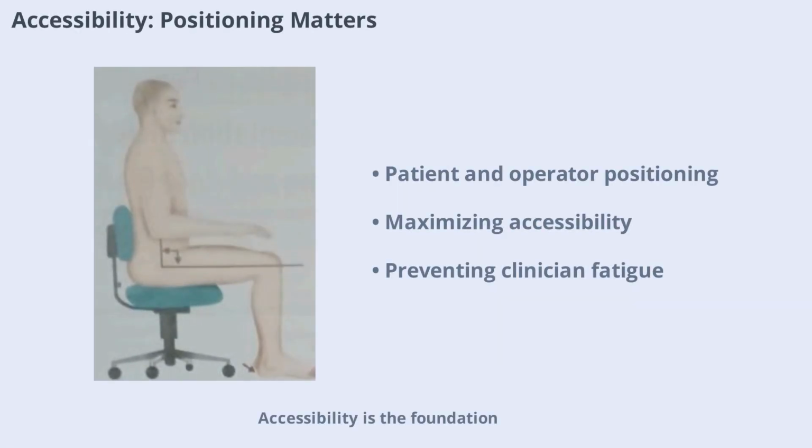Accessibility is the foundation of effective periodontal instrumentation. The position of both the patient and the operator is critical for maximizing accessibility to the treatment area. Poor accessibility can hinder thorough instrumentation, tire the clinician prematurely, and reduce effectiveness.